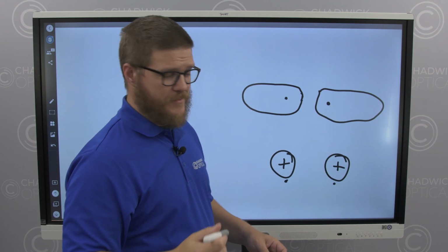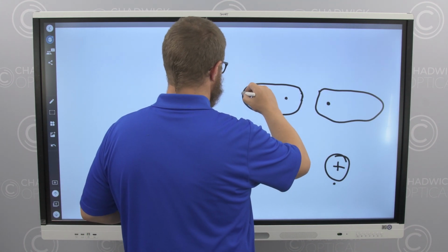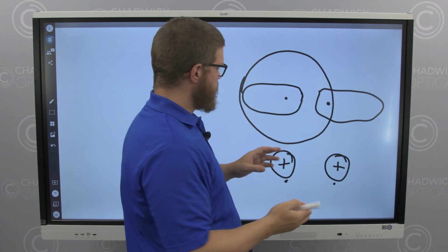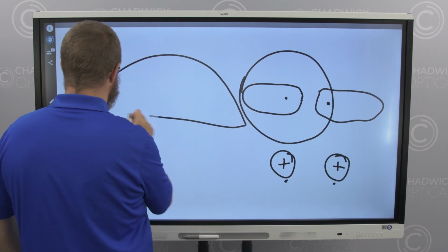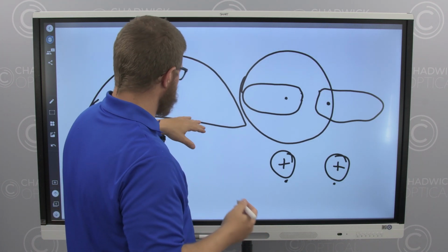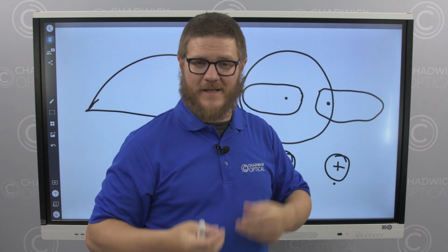So what happens is similar to what we need to do with the rimless frames and the drill mount frames, is we need to make the lens this big so that you can see through it. If we're making a lens that big, we need to make it that thick so that you can fit it into this frame. The other challenge is that the way these lenses are designed a lot of the time, you might have an issue with the back of the lens coming in towards your face and hitting your eyelashes.